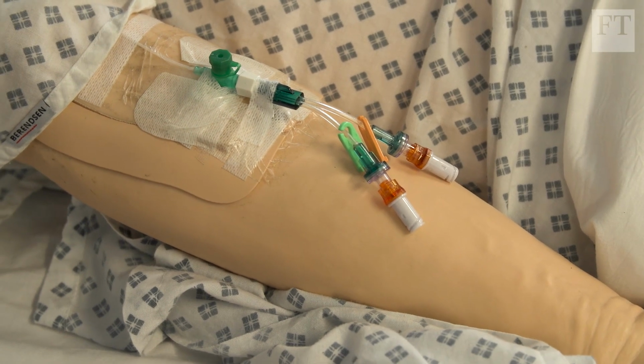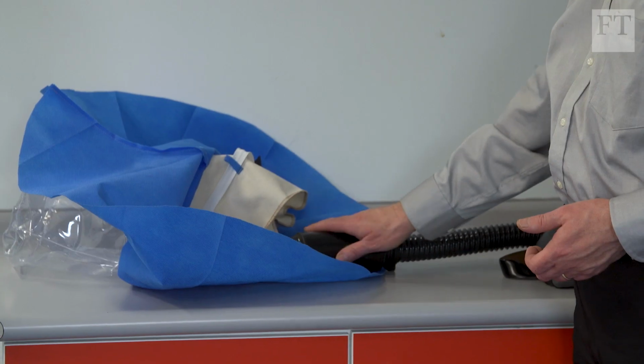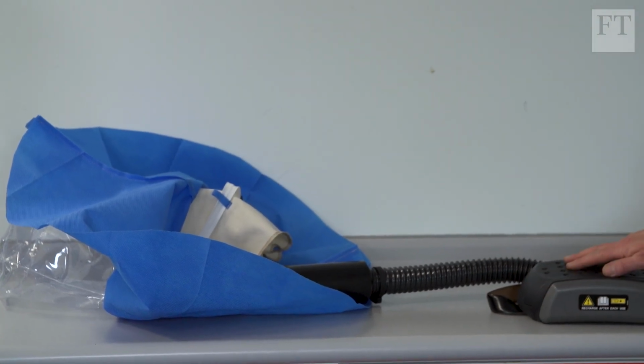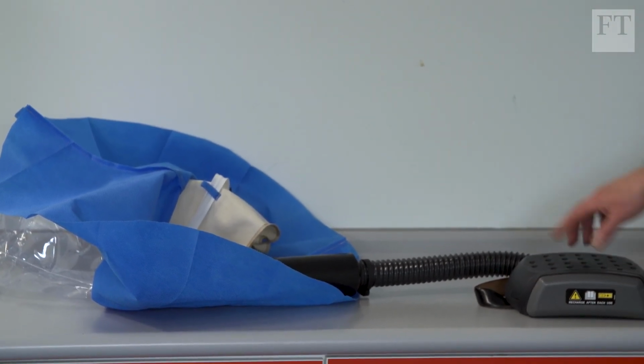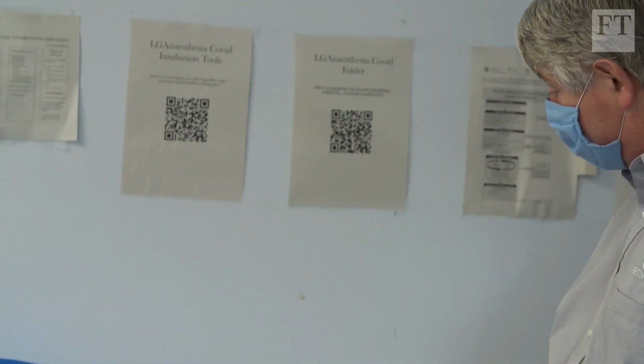Okay, so what we've got here is what we call an air-fed hood. Doctors and critical care staff here at Lewisham and Greenwich NHS Trust in South London have been evaluating Mike's prototype alongside two other designs. Pumps the air through the tube and very importantly through a silencer here, so that there's a minimum of noise inside here, because the fan obviously generates a certain amount of noise, and without a silencer this tube acts like a speaking tube.